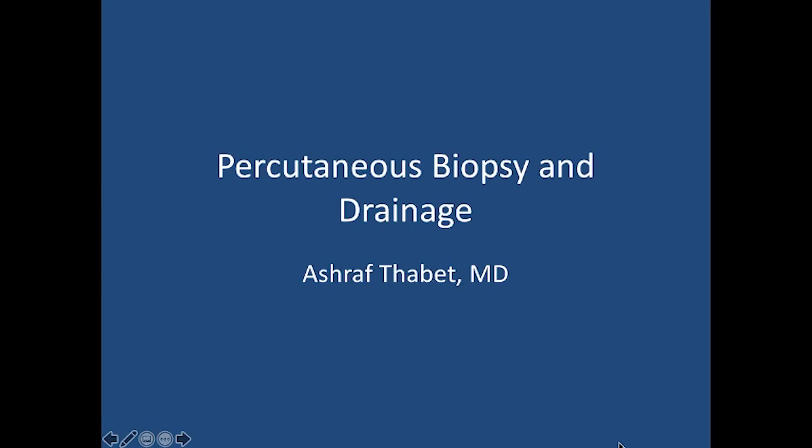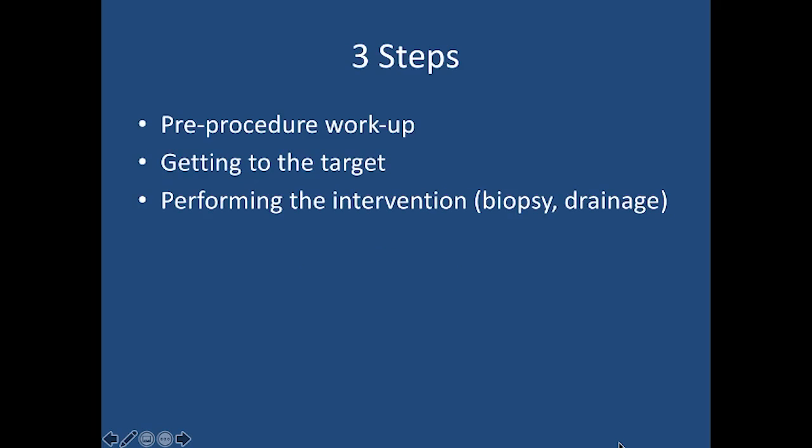Today I will be providing an overview of percutaneous biopsy and drainage procedures. Now, when it comes to these kinds of procedures, there are three general steps: pre-procedure workup, getting to the target, and then performing the intervention.